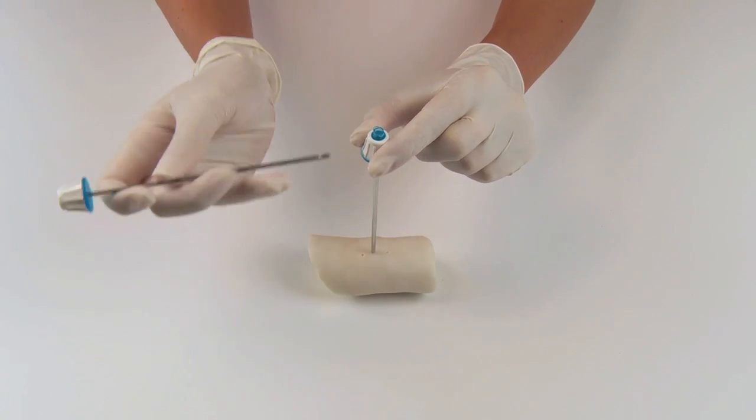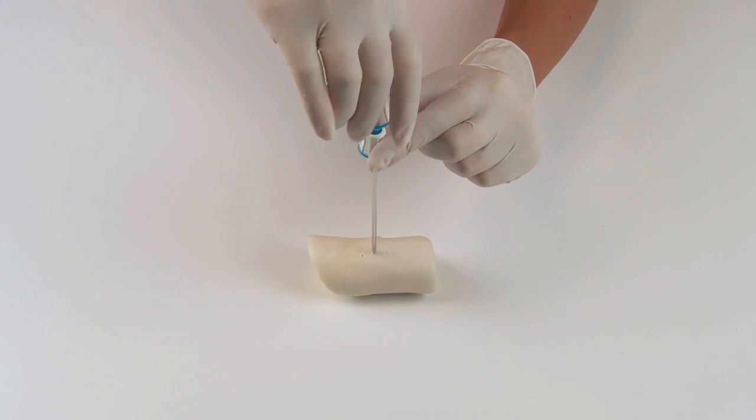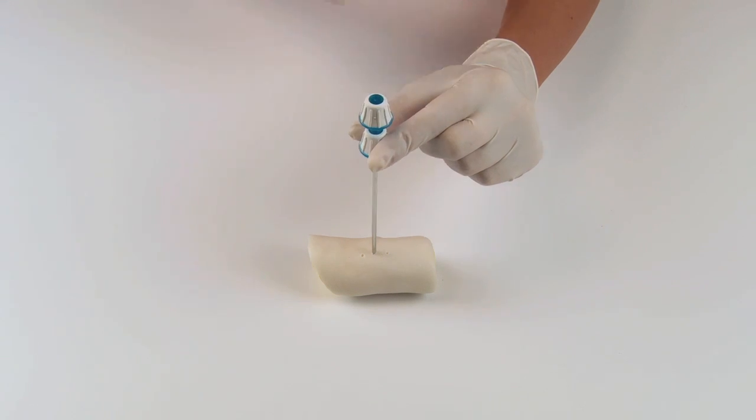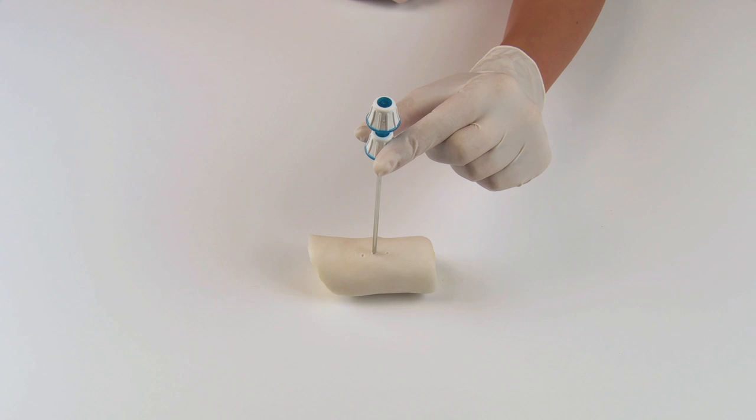Insert the eccentric drill into the penetration cannula and rotate it a few turns until the drill tip makes purchase on the bone. Verify the position and direction of the drill with diagnostic imaging. It is very easy to correct the position and direction at this point.